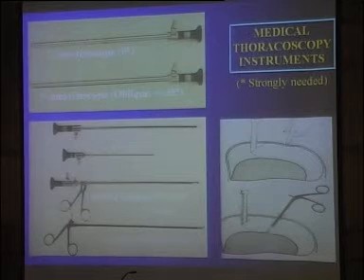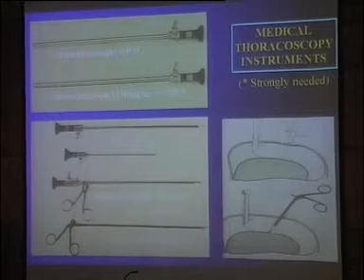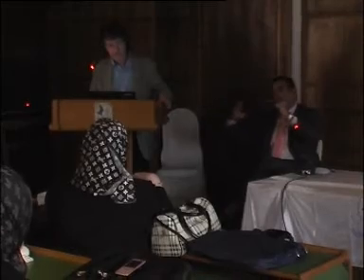The thoracoscopy in our hospital is absolutely different. There is not one port with an optical forceps. You only have a rigid optical telescope, which you can see with, but when you have to take a biopsy, the forceps are without a lens. So you have to have another port and see what you're taking. That's the problem.